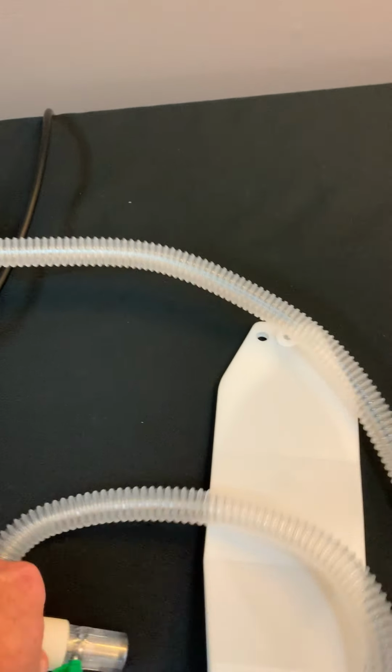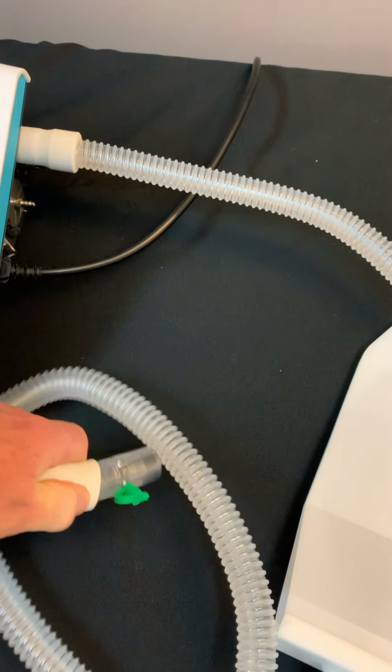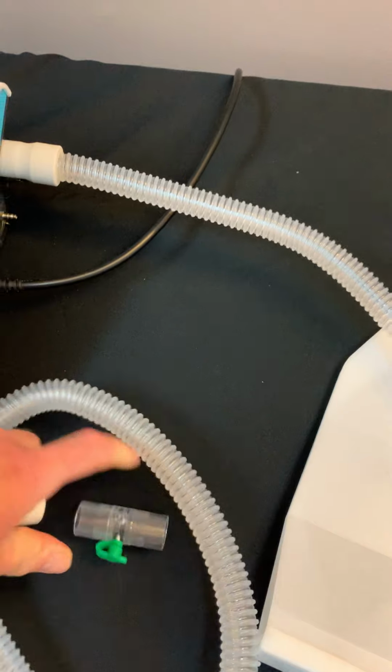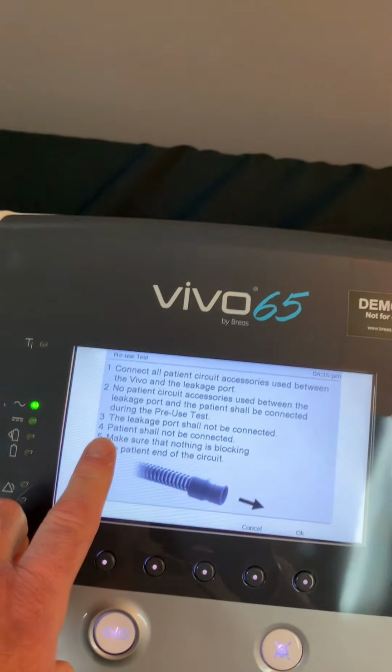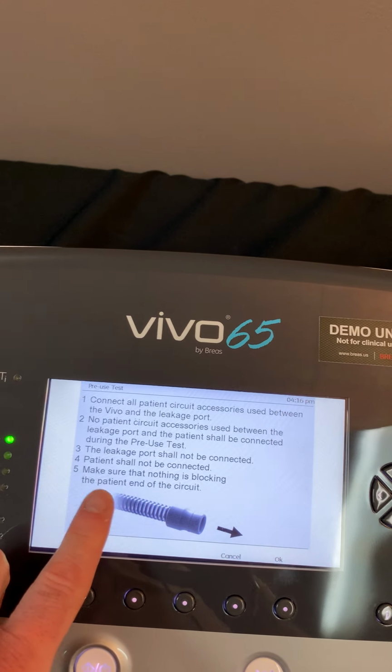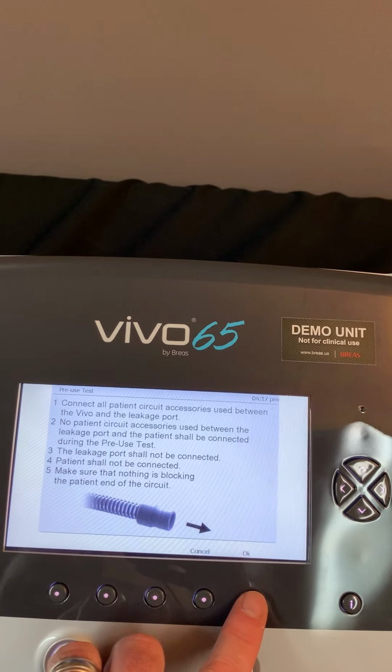I'm going to try to do this with one hand. All right, so we've got the leakage port removed. Number four, the patient shall not be connected. And then number five, make sure that nothing's blocking the end of the circuit. So we're going to go ahead and click OK.